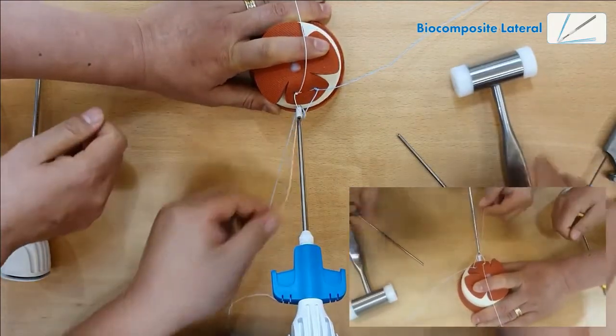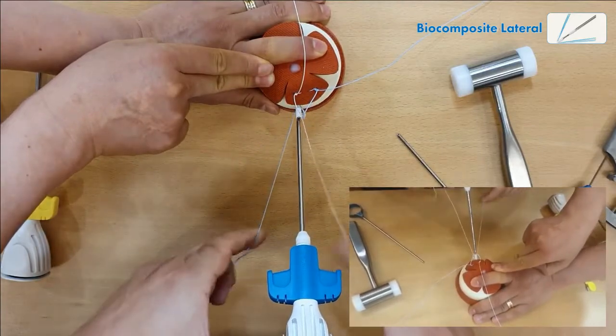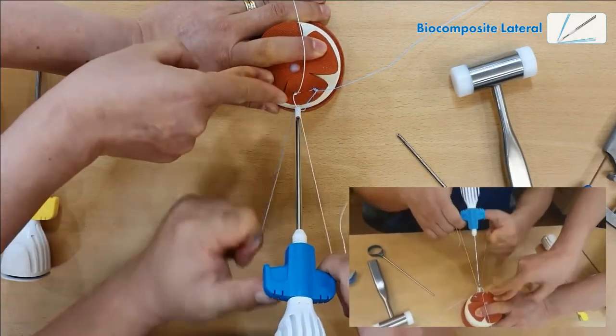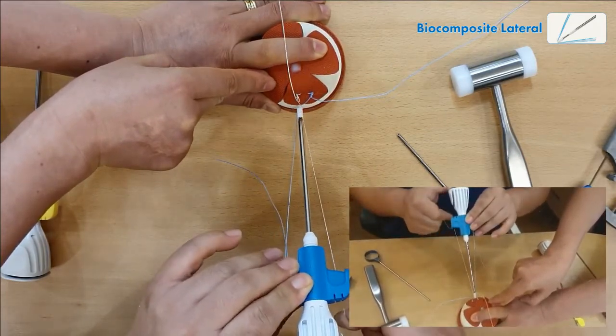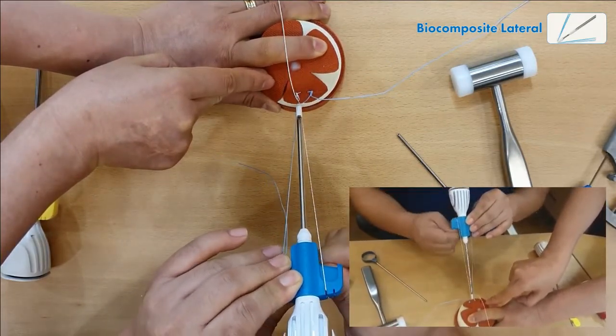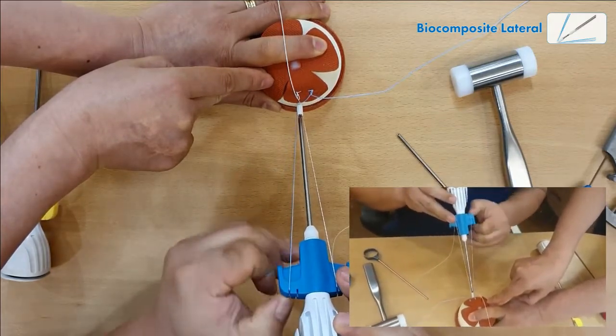Now, we have passed to the screw where the screw is in. Just pull it up. Now you can tie it up. Just give the tension that you want and put the fiber wires on those little holes here.